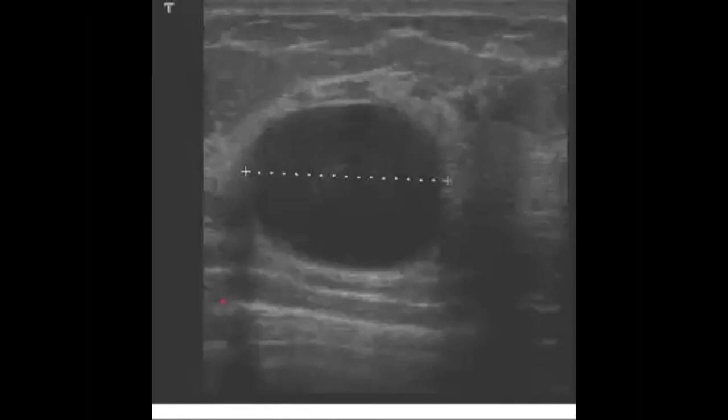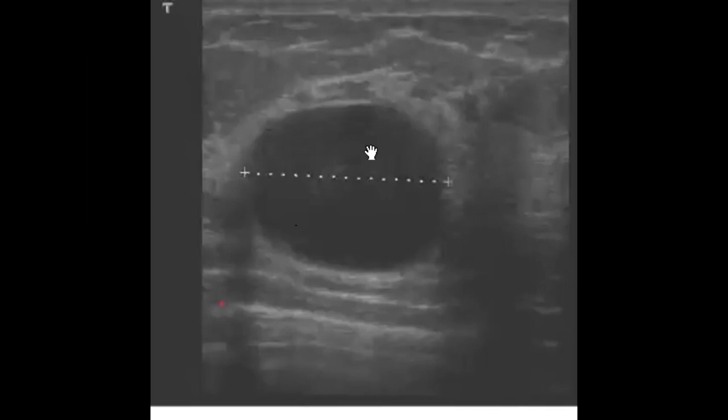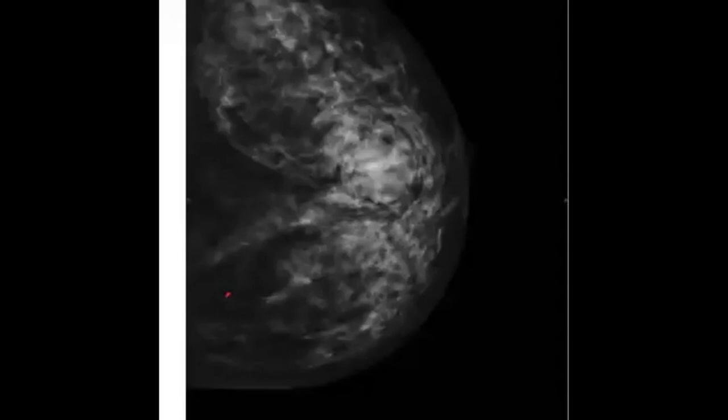cysts. Differential diagnosis: probably with this ultrasound it will be a cyst, but for the mammogram alone they like to put some differential diagnosis, like fibroadenoma, for example. So the most important thing in the management is that you ask for ultrasound, as you mentioned, which is the most important to know for discussion, and to know that if you find a cyst, nothing will happen after. Maybe sometimes if it is a very large cyst, you can do ultrasound and aspiration in this case and see.